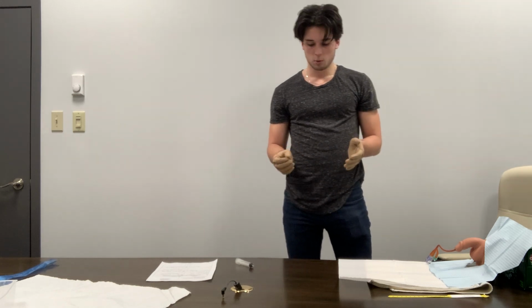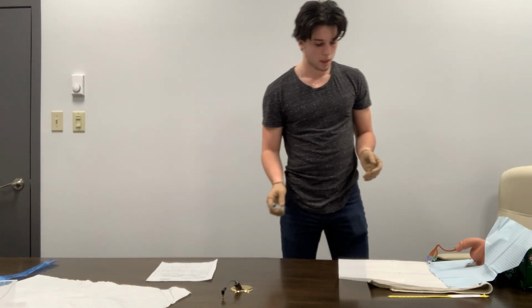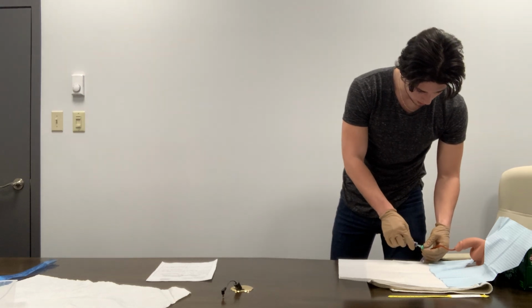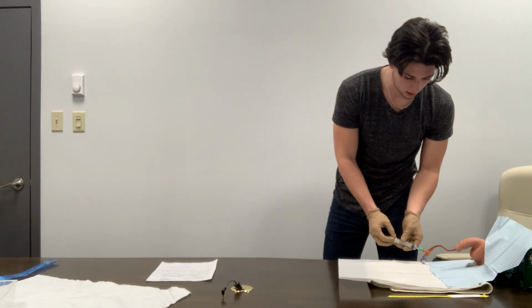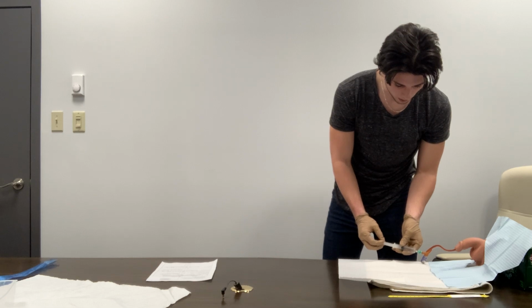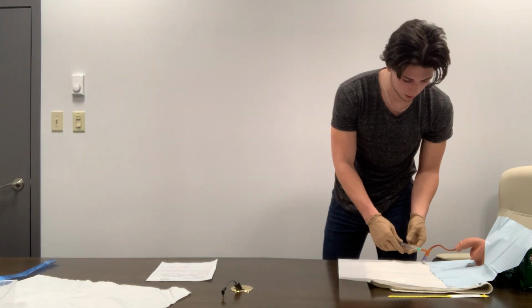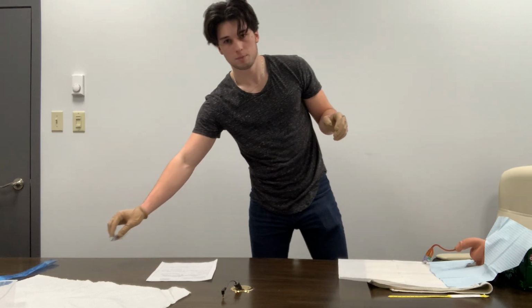In this process, we're going to start off by grabbing our syringe and attaching it into the port for the syringe here. Once that is attached, we're going to pull out the 10 milliliters of sterile water. Once the 10 milliliters of sterile water have all been pulled out, we can go ahead and disconnect our syringe and throw this directly in the garbage.